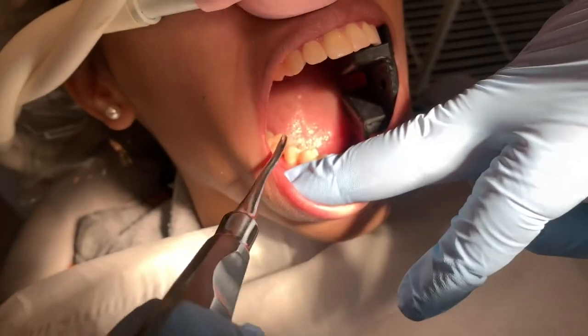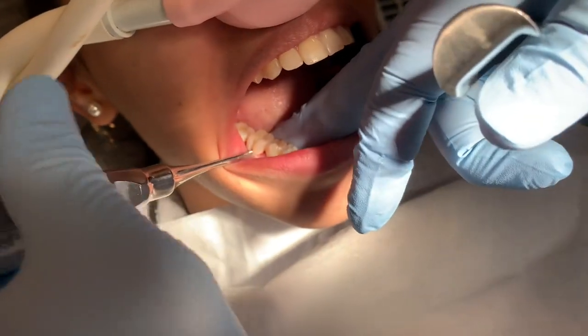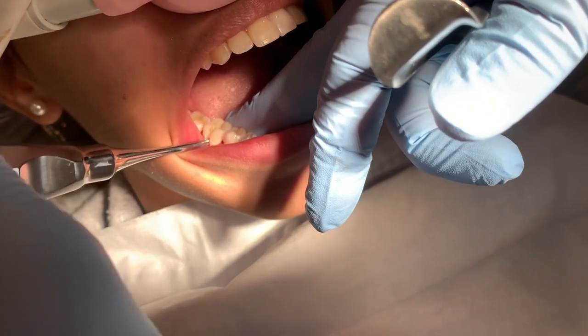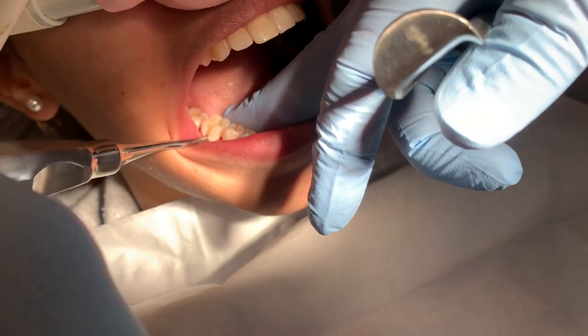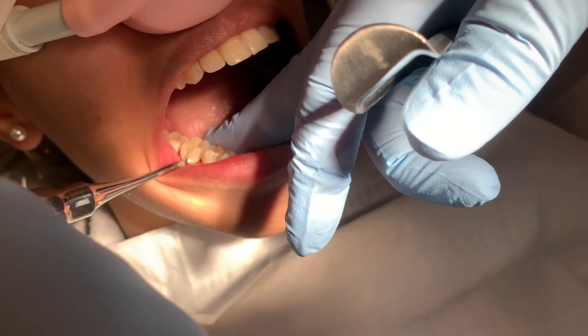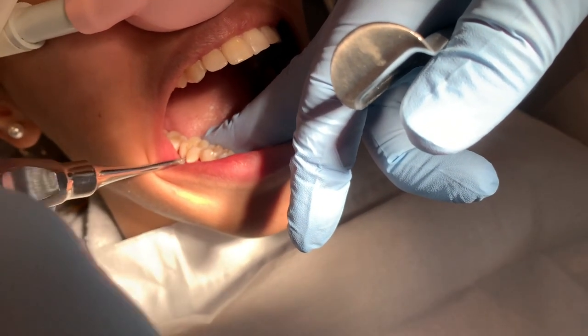Okay, so the next thing I'll do is I want to get in here and just make sure we have the tooth in two pieces. So I'm just going to kind of wiggle this. You may hear a little pop or something. Okay, that's the tooth kind of finally gets into two pieces. You can hear a little bit of stretching noises sometimes.